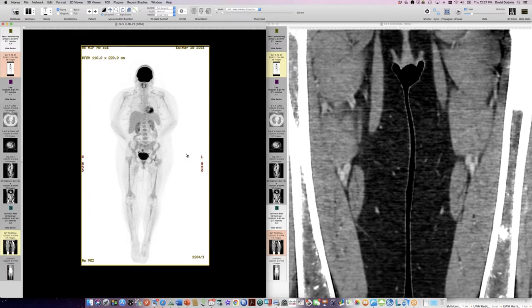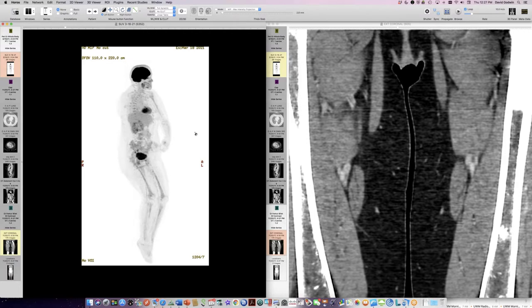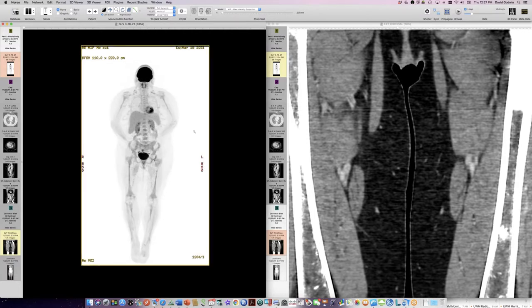So this is Erdheim-Chester. We don't have lung biopsy to establish it, but we know it can infiltrate the lung. We don't have pleural thickening here or mediastinal thickening or halos around the kidneys. So it's a quiescent, I think maybe partly burned out Erdheim-Chester. So septal lines were abnormal, and a lot of imaging is abnormal here, and it's hard to put it together, but you guys, you did it. Wow.